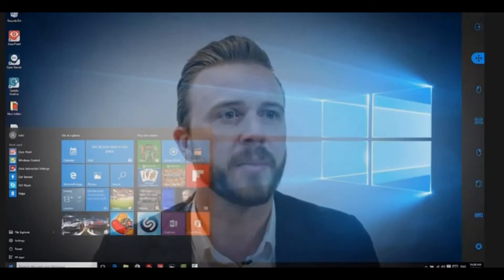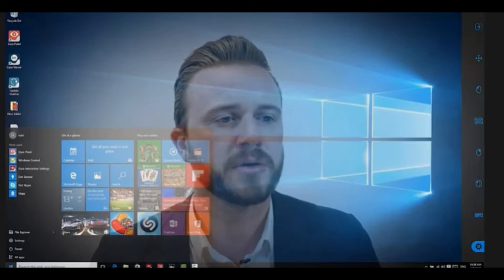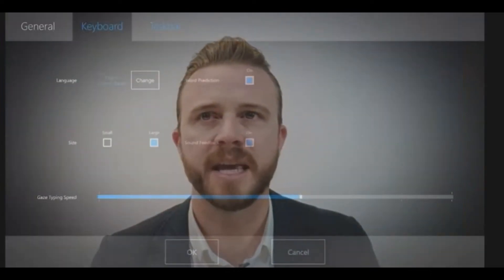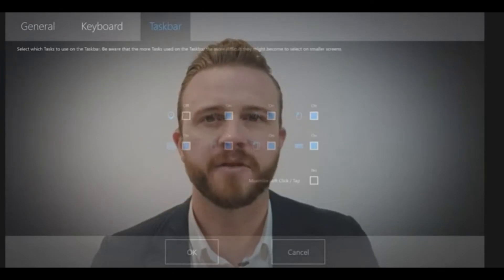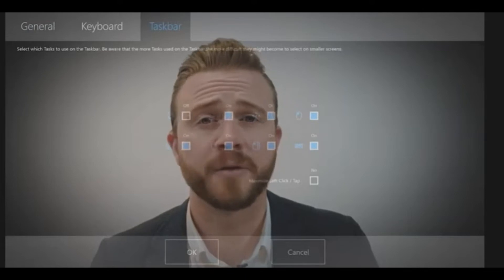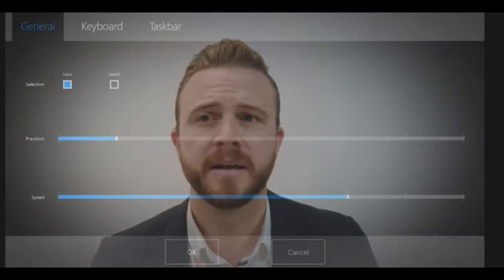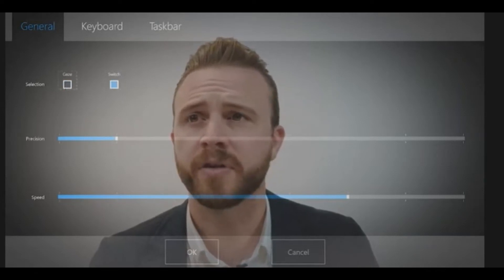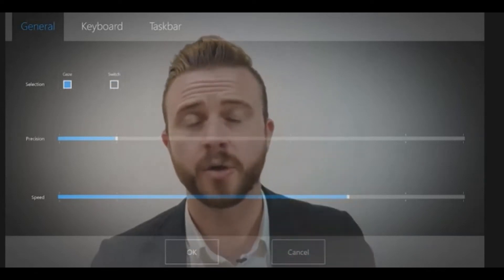When you look at the taskbar, it follows your eyes as you look up and down. This allows you to go into settings and control different types of settings with your eyes — changing the keyboard language, changing the different tasks on the taskbar, adding different word prediction languages, adjusting the speed and precision of the zoom, or even switching between selecting with a physical switch or just using your gaze. That's basically gaze selection — an absolutely fantastic way of using your eyes to control your entire interface.